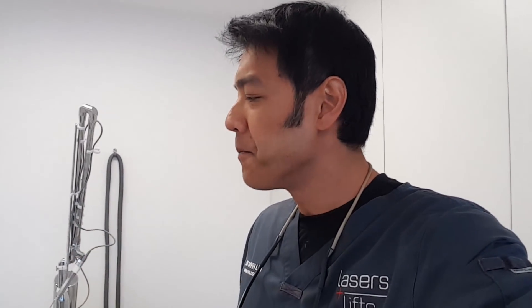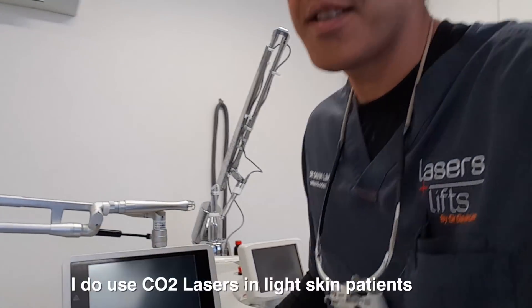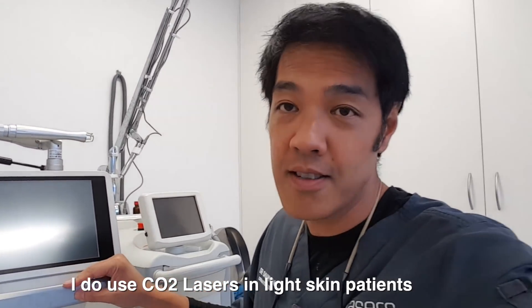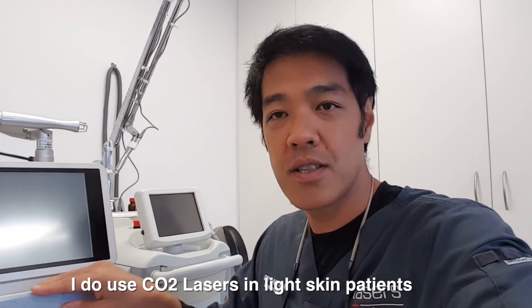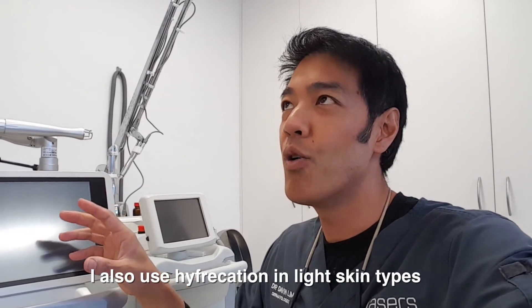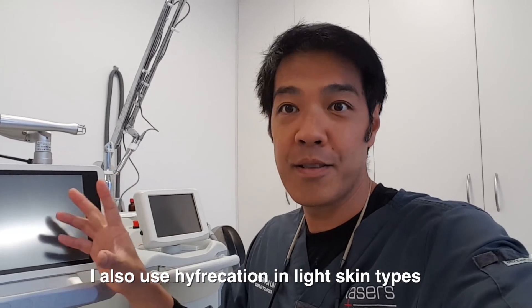I'm going to teach you four methods about how to remove them, but I'll show you two. This is one of my two favorite methods. For a fairer skin type, I do use a CO2 laser with a one-millimeter spot size to ablate or desiccate and remove these age spots.